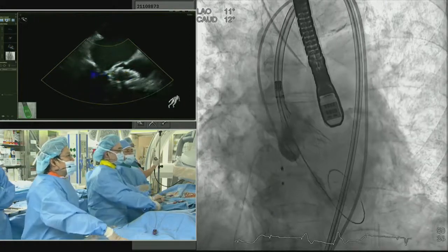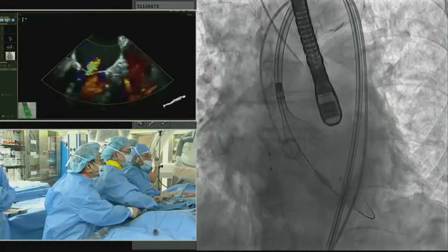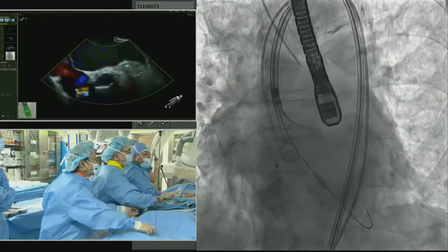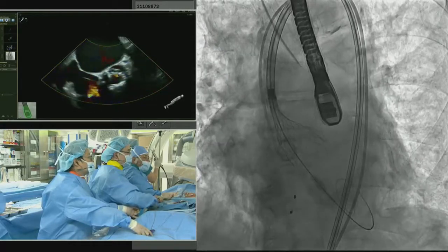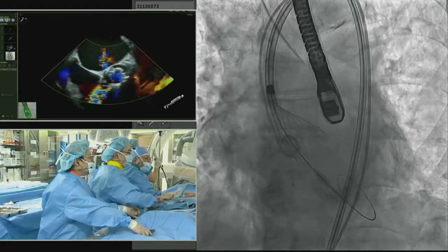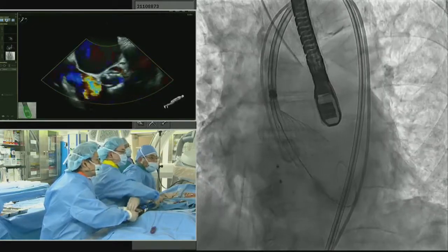What we did notice with repositioning is that acute kidney injury is more common, and that's because you have a greater contrast load. You know, I think this point is extraordinarily important, particularly in this case where we received 100 cc yesterday and then coronary interventions and on top of this, this contrast. And some hypotension. That is not the best thing for the kidneys.